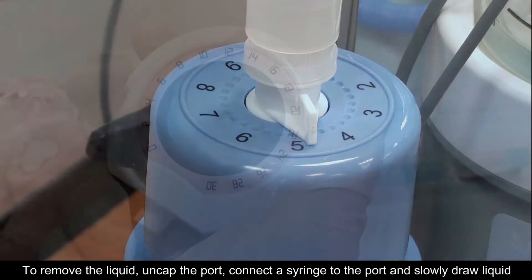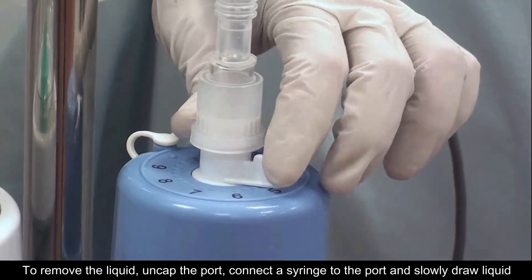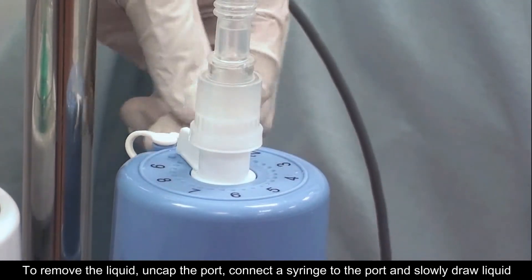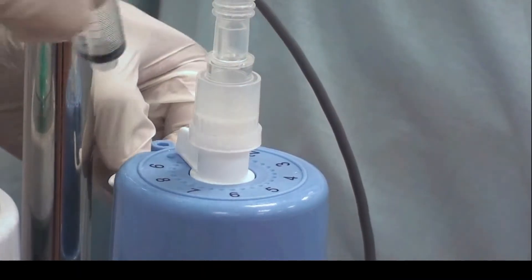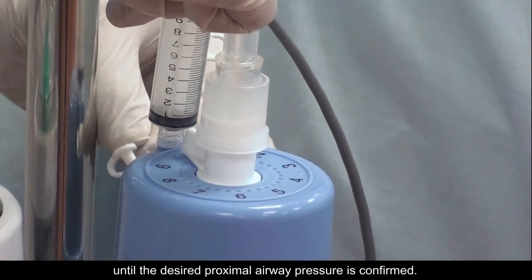To remove the liquid, uncap the port, connect a syringe to the port, and slowly draw liquid until the desired proximal airway pressure is confirmed.